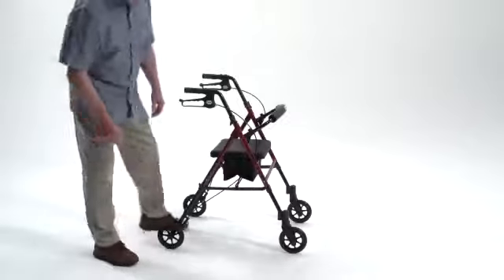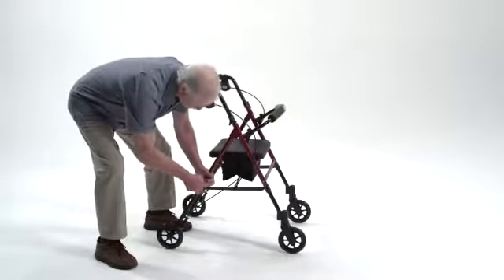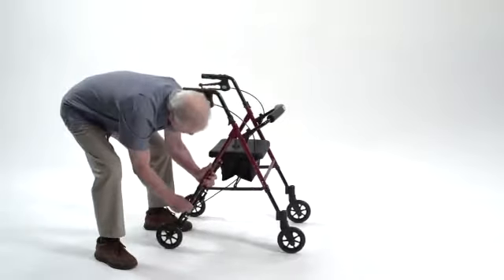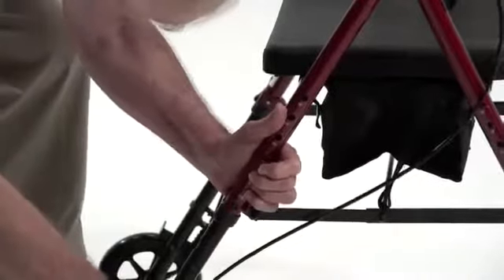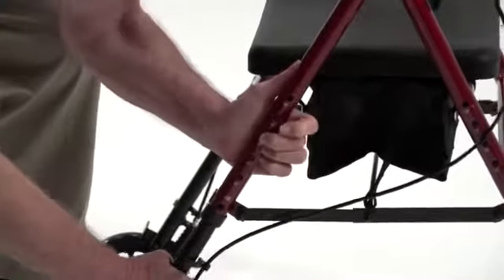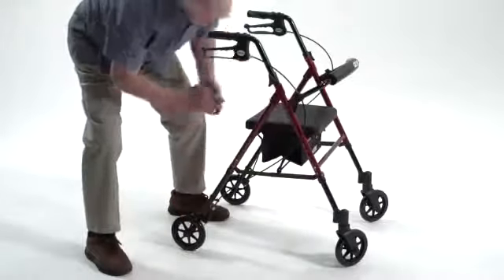This tool-free height adjustment allows users to adjust the seat from 18 to 22 inches in one-inch increments to accommodate their individual height. To adjust the height, simply depress the brass push pins, adjust the rollator to the desired height, and secure in place with the lock knobs.